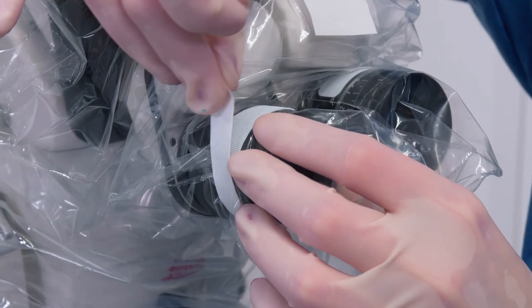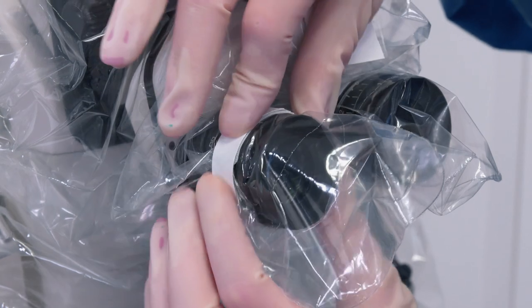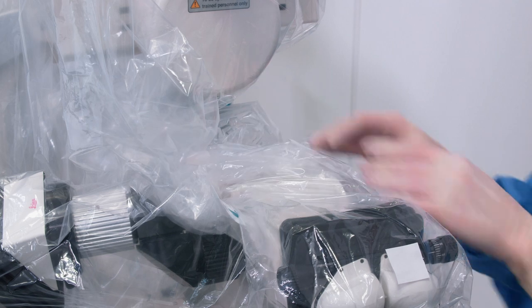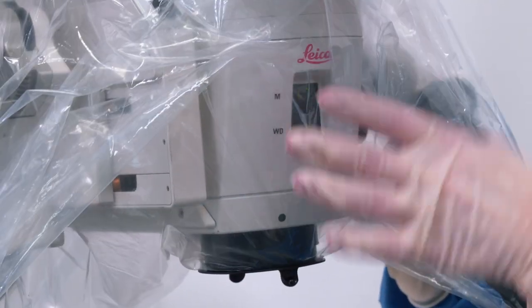Secure the drape using the velcro straps. Put the remaining drape inside the empty space. Make sure the drape is not covering the lens.